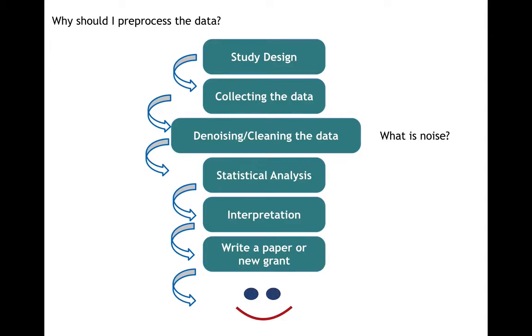But again, for each study, it's better to understand what the goals are, and that would make it easier later to decide about the denoising approaches.